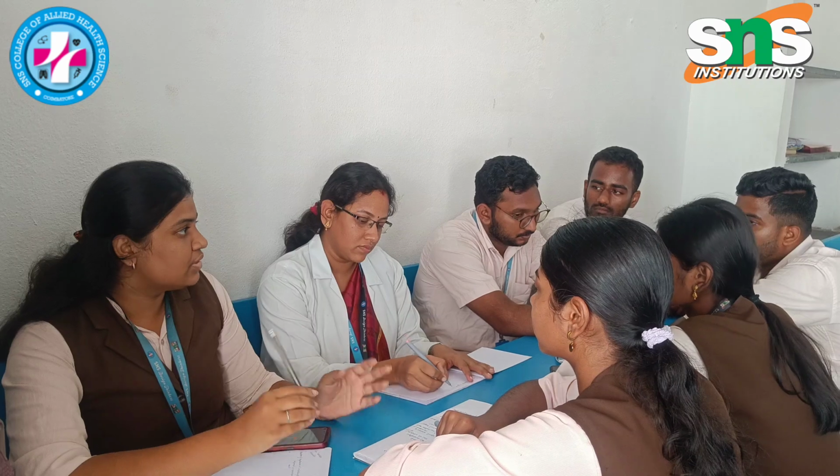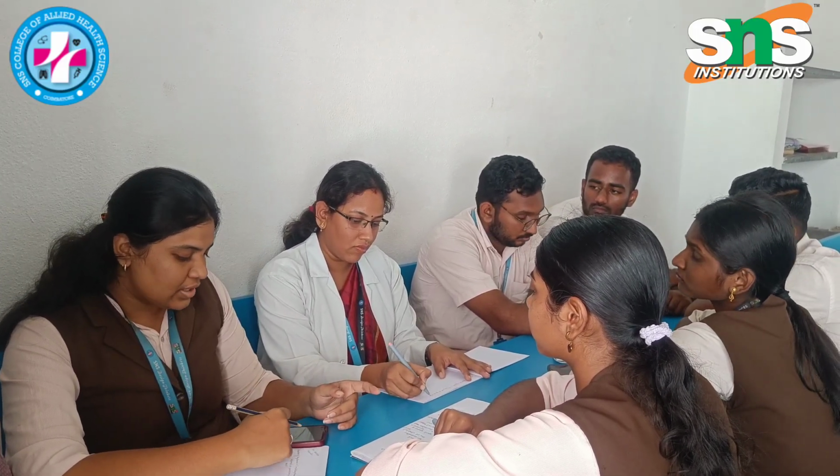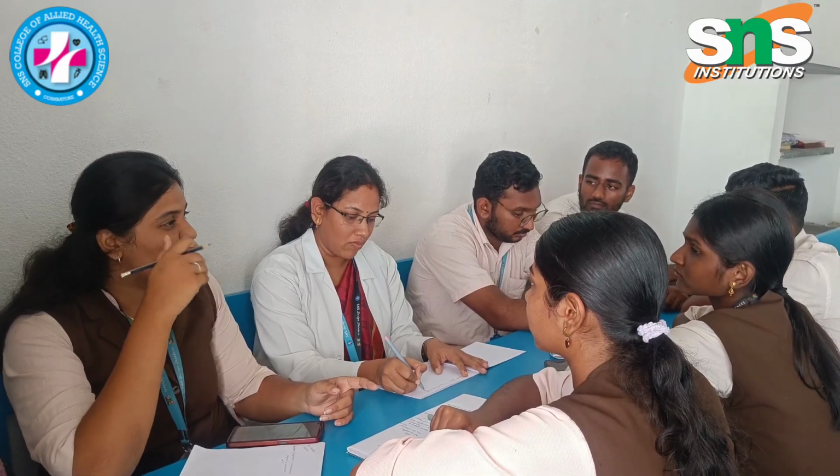The indications are aortic repairs, complex aortic surgeries, and some congenital heart diseases, and also as a bridge to wean from full CPB, we can use partial CPB. If we see the disadvantages, to balance those flows we have to give flow to the upper body with the regular circulation and also maintain the lower body circulation. Balancing this will be a little difficult, and there are technical limitations, that is, usage of cannulas can sometimes be improper, so the risk can be higher. So this is what partial CPB is.